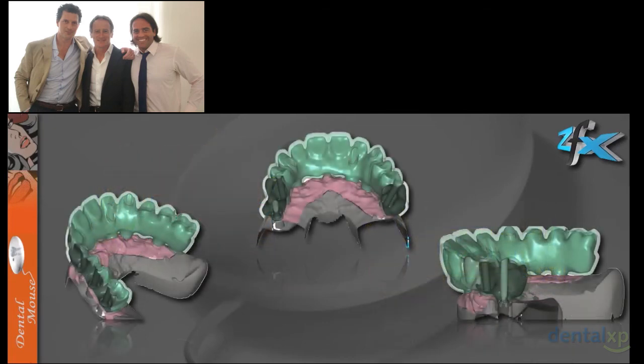And this is the final project that Luca did for this case, and you can actually evaluate inside on this right side picture, you can see where the canal is, so where the voids of our framework are and how much thickness you have. So you can do a lot of sections of your work and see if everything is done correctly. You can see how much information, how many tools the new technology is giving us, because the thickness is one of the keys to the success, to have a long-term prognosis of the new material.